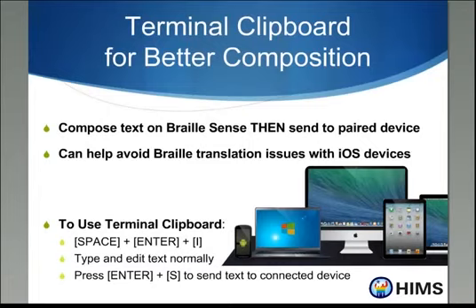Space. Hello. Rewind. Space. This. Space. Mode. Space. Space. Well. And you heard the phone as it got the text from the BrailleSense, and now we'll just go to Send, Send. Button. And I did send that from iMessage, using my BrailleSense, and we'll send it.